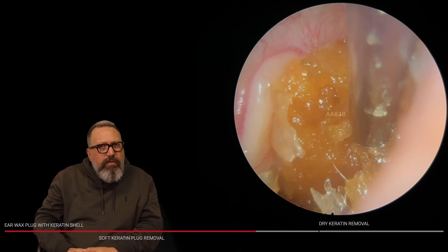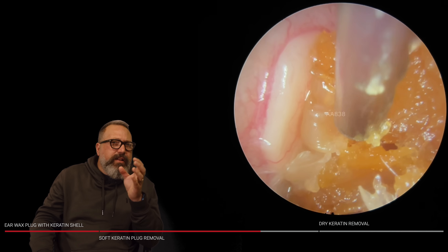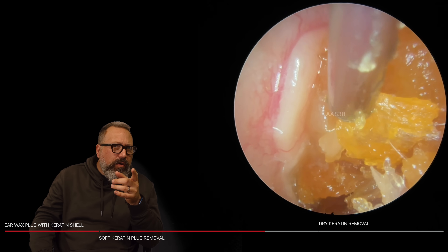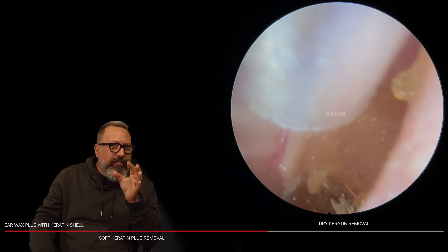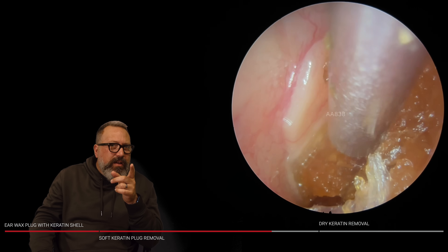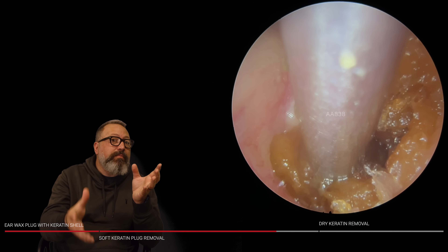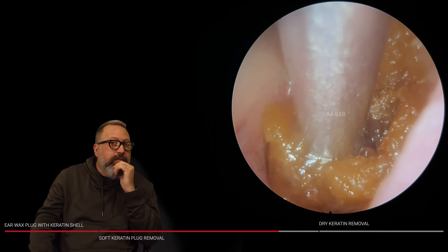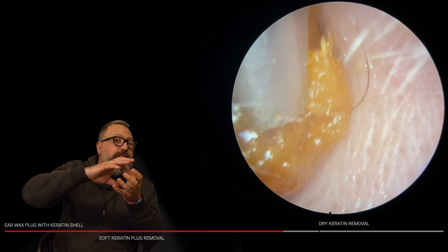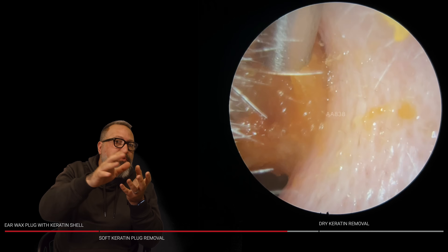Let's see if we can get a little bit more of a grip. The fine end is great for stopping any kind of clarinetting or for pinpoint accuracy, but rubbish for suction power though. That whole section there just looked like it was going to lift. So I've got rid of a lot of the skin and opted to go in with the standard size on the tube. You can see how that standard size with a slightly wider aperture is bringing this out of the canal. The whole plug is now moving — we're using the keratin against itself. We're holding on to it and pulling, and because it's all bound together and sandwiched together, it's pulling the whole plug in one go.